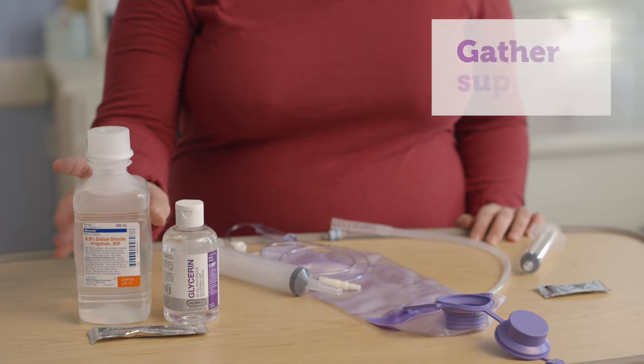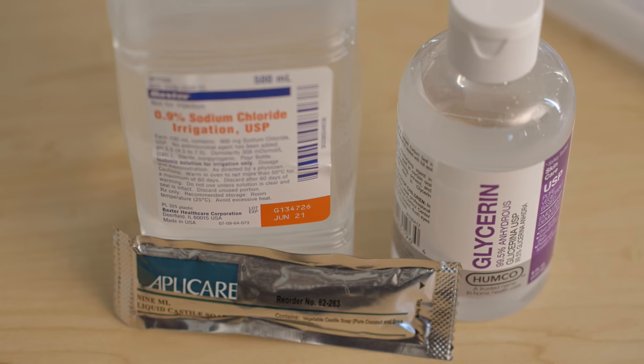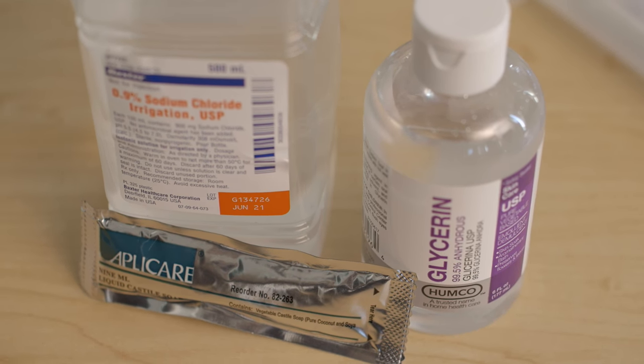To get started, gather your supplies. This will be saline and either glycerin, castile soap, or a combination of both, depending on what was ordered for your child. The saline should be room temperature or warmed under warm water like how you would heat up a baby bottle.